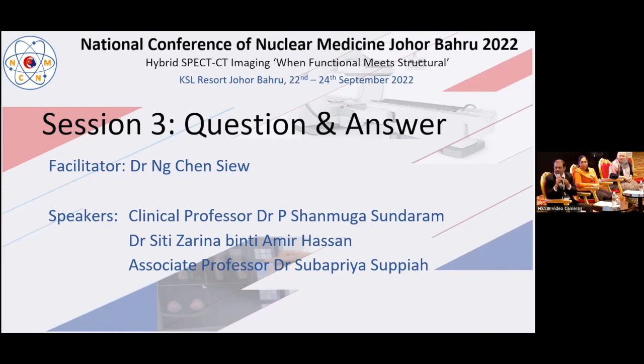That's my concept and that's my understanding of why I don't combine it. But I am not going to criticize you for doing it. I personally feel the delayed imaging specificity goes down with the background uptake of pertechnetate because of this initial thyroid scan.